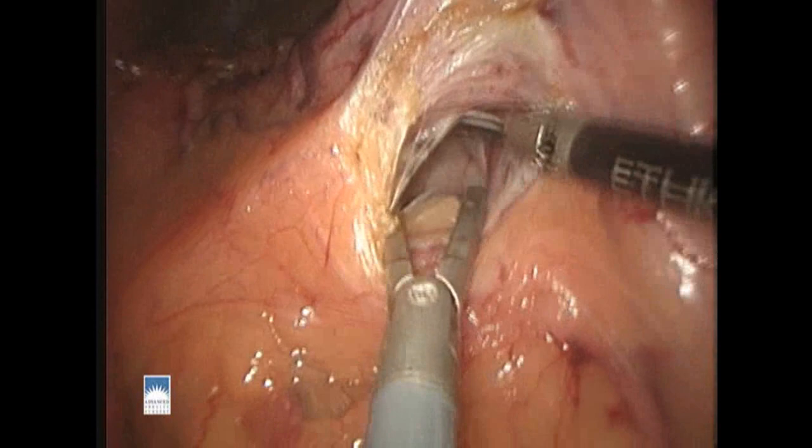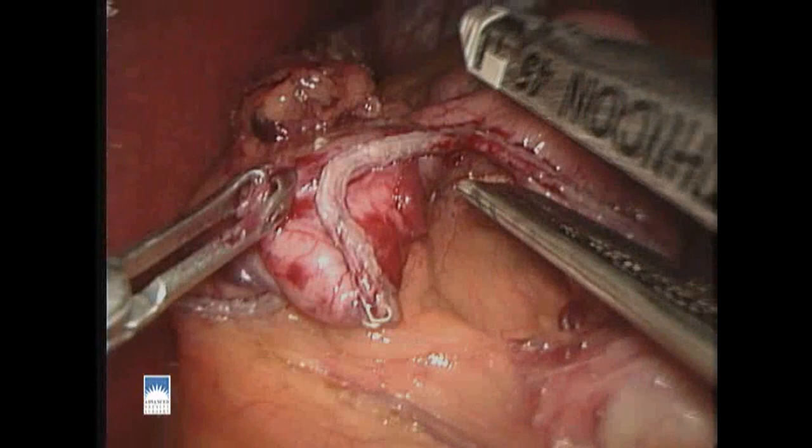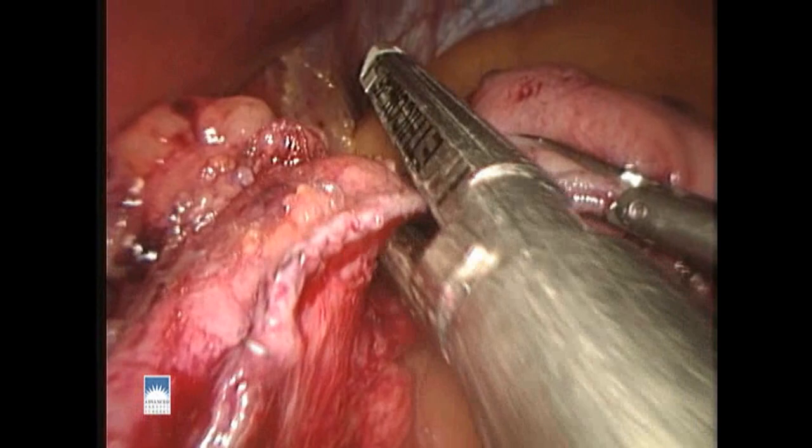Here we're gaining access to the lesser sac, which is an open space behind the stomach. We can now get the stapler jaws around the stomach and make our first firing, which is transversely across the stomach wall. We then aim our stapler toward the top of the stomach and finish the stapling of the stomach pouch. The stomach pouch will hold about 30 cc's at one time. We make sure we've completely divided the stomach pouch from the rest of the stomach.